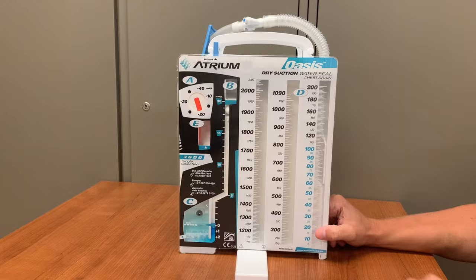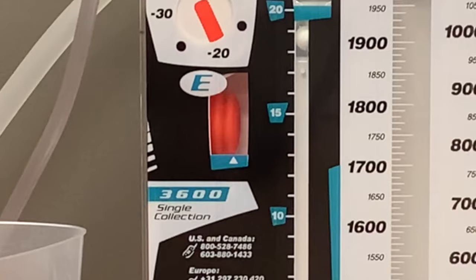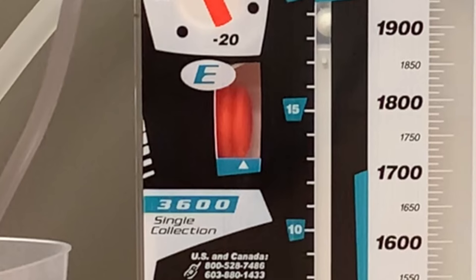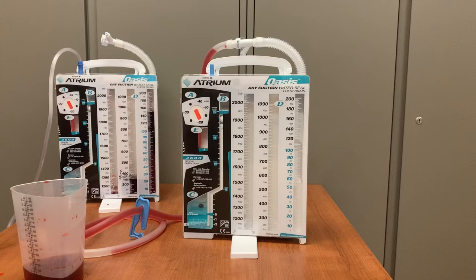If it must be changed, there is a small wheel on the side of the Oasis that will allow you to spin the dial to the desired amount. The chamber directly below the suction dial, labeled E, contains a small orange bellows. When suction is turned on, these bellows should expand into the visible window. A triangle denotes the proper inflation when the suction is set to negative 20. If you are set to negative 20 and the orange bellows does not reach or exceed this marking, there is not enough suction being delivered to the patient. You will either need to increase the suction coming from the wall control if it is set too low, or it could mean the Oasis is not functioning properly and you will need to replace the unit.